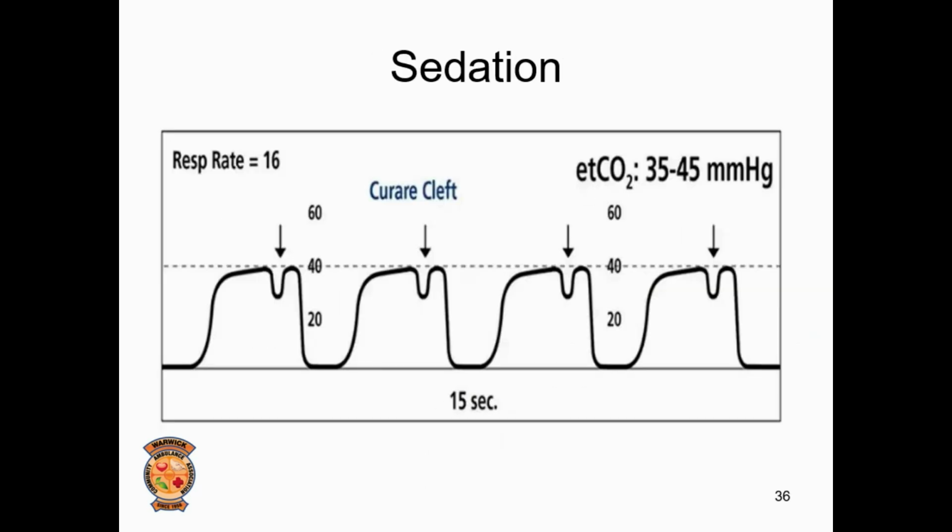Another non-cardiac arrest use of capnography in an intubated patient is the monitoring of sedation. If you see the little curare cleft there on each end-tidal CO2 waveform, that's indicative of the patient coming out of their sedation.